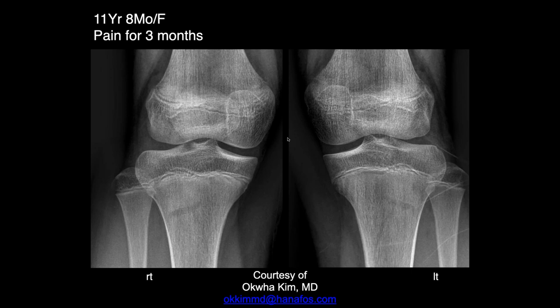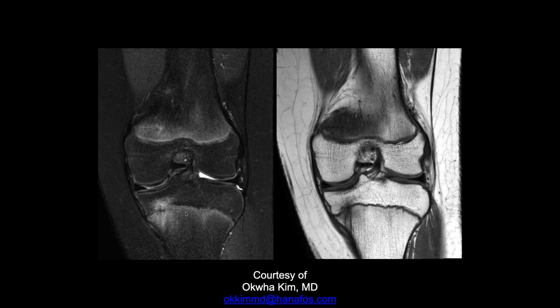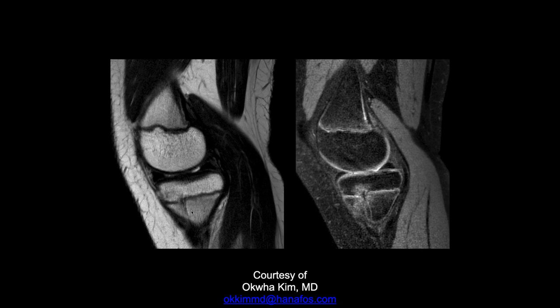Jennifer, what do you think of this case? All right, so we have an 11-year-old with pain for 3 months. I don't see any definite fracture plane here. There's that lucency there along the tibia, but it's bilateral. So I'm thinking this could be some Salter-Harris II fracture. It looks like there is some lucency extending through the cortex, but it is bilateral and it goes through the physis. Yeah. It could also be a stress reaction.